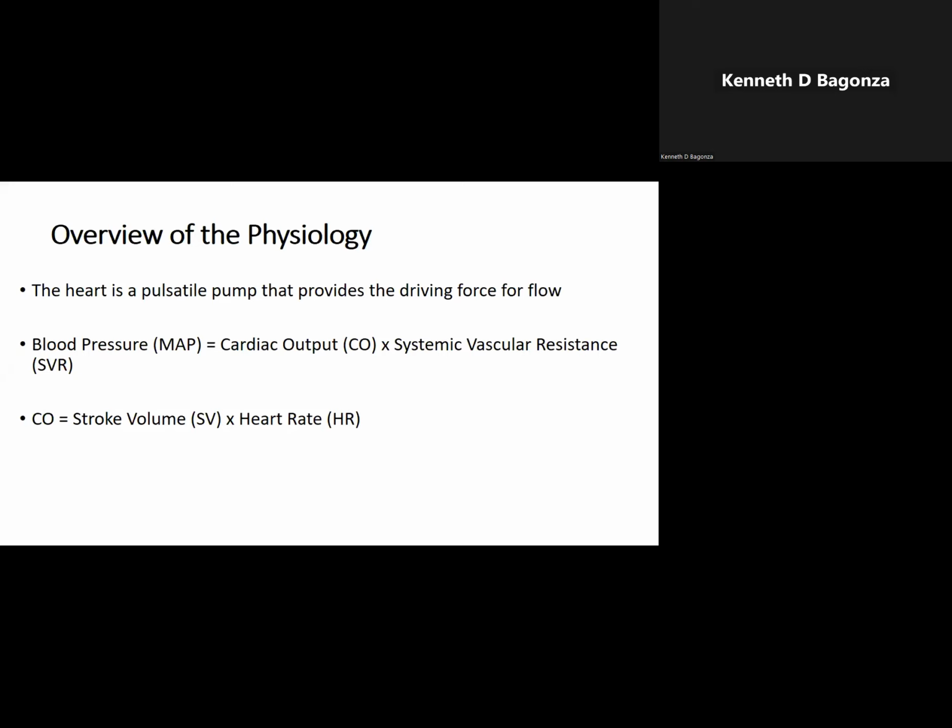Okay. And once you deem the patient as having those 5 things we looked at that denote instability, then cardioversion for tachyarrhythmias would be your go-to intervention, electrical cardioversion. And you can do this using defibrillators. I know that some places may not have defibrillators, so that might be a bit challenging. But if you have a defibrillator, you need to be trained on how to use it safely, because you can hurt yourself in the process of using it, but you might also hurt your patient and your colleagues.